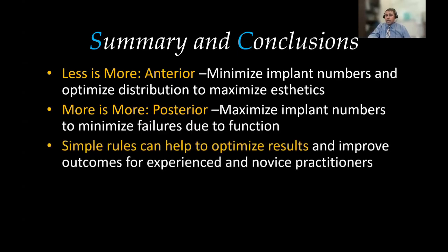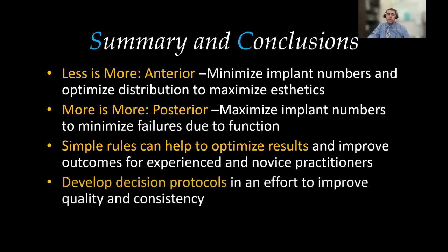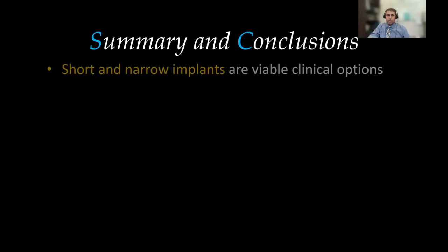Simple rules are needed that can help you optimize the results, similar to what we're presenting here, and improve the outcomes. And that's whether you're an experienced practitioner or a novice practitioner. Simple rules always help, and simple guidelines always help. Develop decision protocols in an effort to improve quality and consistency for your treatment, for your planning for the patient.